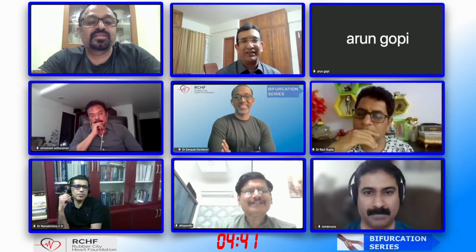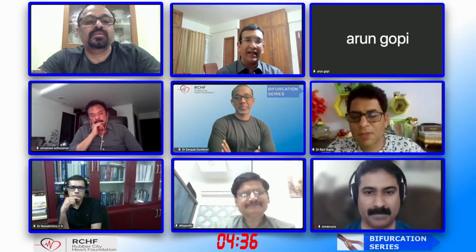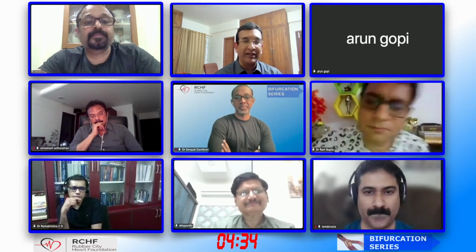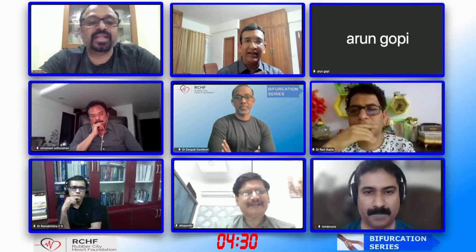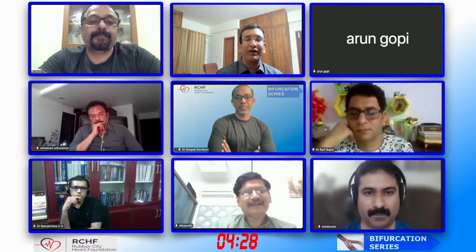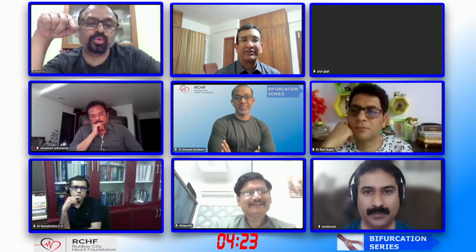It's the same thing, Natarajan. See, when you do the mini crush, first you put the stent like a TAP, instead of at the carina, the long stent coming in is crushed. What do you call the mini crush? The same thing. Okay. But in the EBC language, they call it the inverted crush. That's the only thing. The reverse crush is a technique used for bailout.